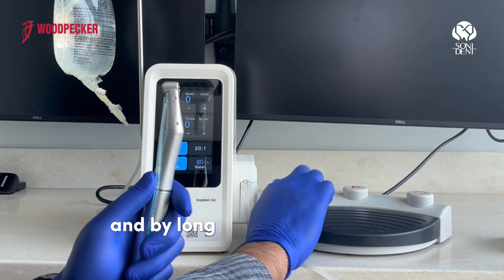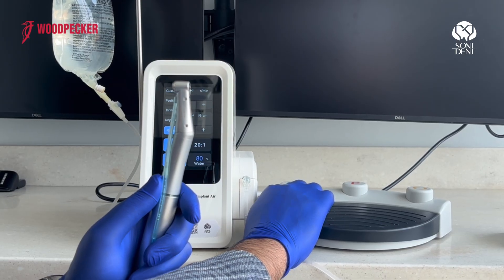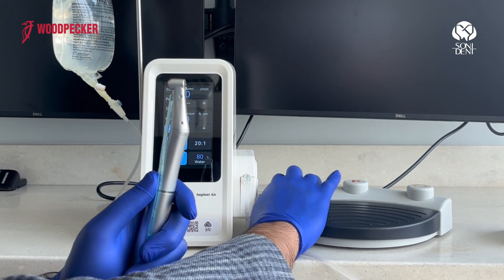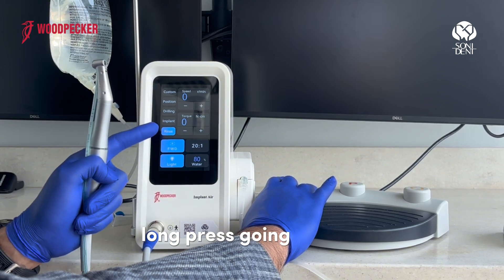By long pressing the water button on the pedal, you're going to change the program to rinse. Long press again and it goes to drilling. Long press again and it goes back to rinse.